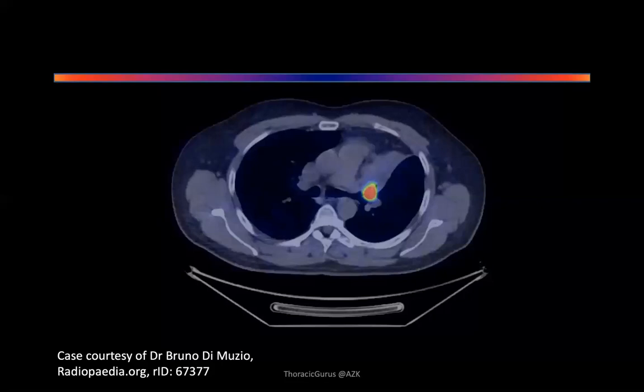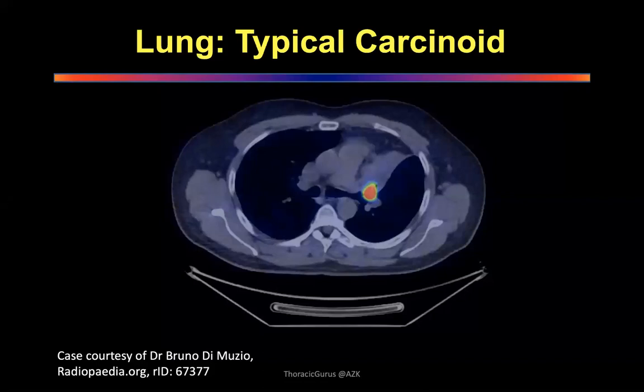But of course, we don't know that at the moment, because this could be lung cancer. But if you think it's carcinoid, say it's probably a DOTA PET, because the great uptake is always seen on DOTA, not on 18 FDG PET. Otherwise, the collapse and consolidation. Otherwise, for a hot lesion, can we give a differential of carcinoid?